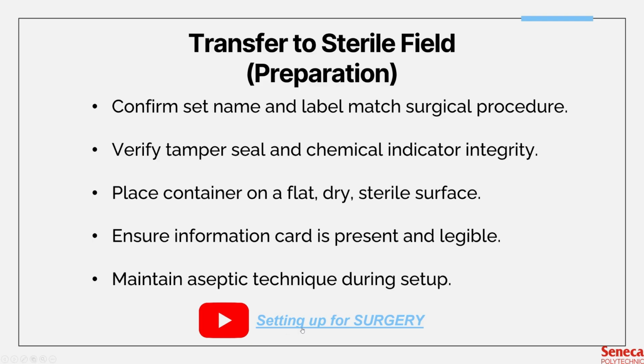So I have a video here that I recommend you guys watch. It just shows a brief look at how surgical technicians or scrub nurses set up the sterile field. So how they gown up, for example, and how they drape the tables in preparation for setting up instruments. So these tables are where they will be placing instruments, for example, all the trays, wrap trays, pouches.